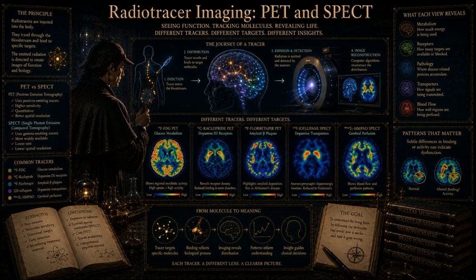But hold on. To solve these equations, the standard two-tissue compartment model requires you to know the input function. You need to know exactly how many cars are on the motorway. To get CP, you have to insert an arterial catheter, an A line, into a patient's radial artery in their wrist. You have to draw arterial blood continuously for 2 hours, run it through a centrifuge, and pass it through a high-performance liquid chromatograph to separate the intact tracer from radioactive metabolic waste.